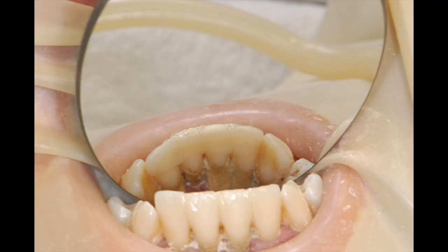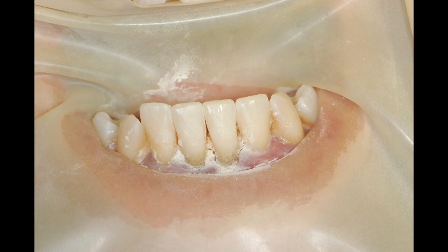Occasionally, a new patient will present with their own naturally occurring block-out material forming on the lingual and the buccal surface.